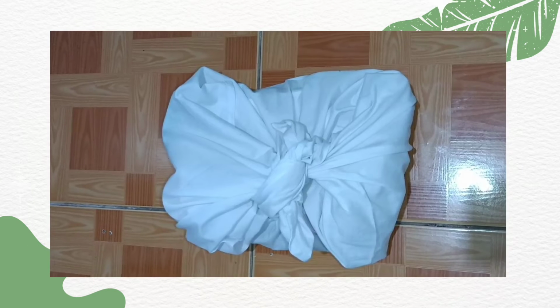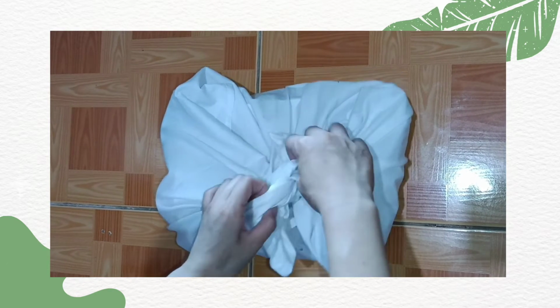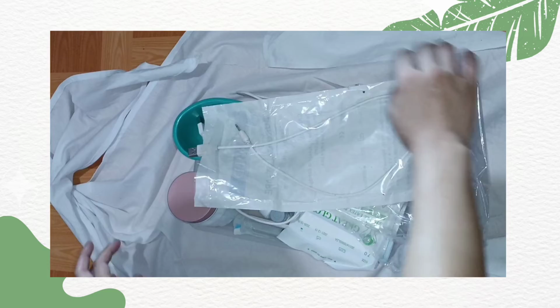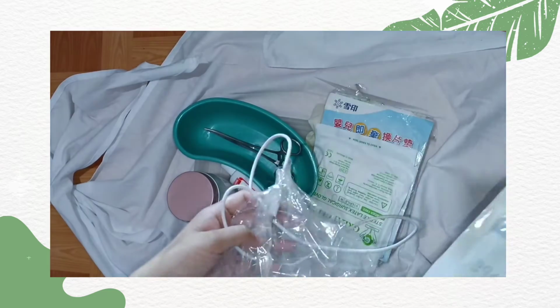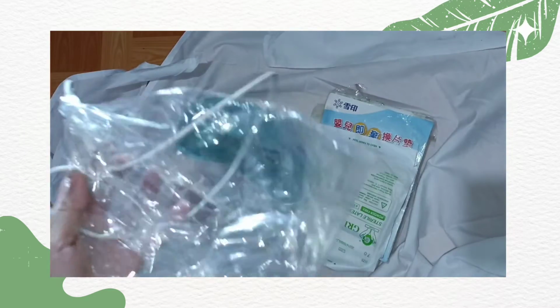I already provided for the client's comfort and privacy by screening and closing the room. These are the equipment needed. We have the catheter set, which contains the catheter. I improvised the catheter, so let's assume that this is the catheter and the catheter bag.